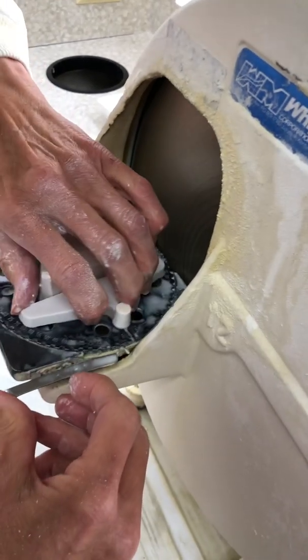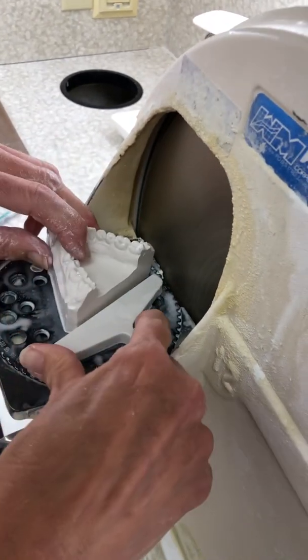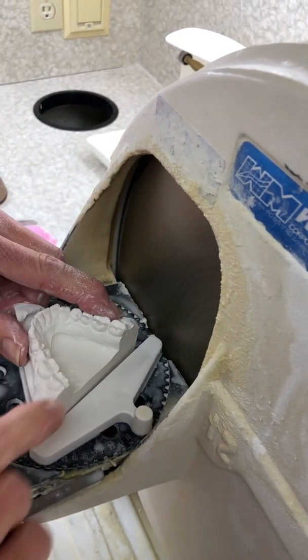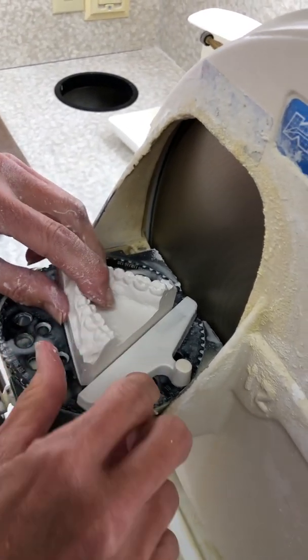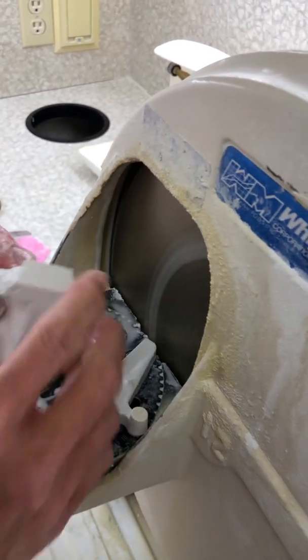So that's at 115. So 115 degrees, let's set our gauge for this and just push in. And you want to watch again that you've got to do it on both sides. So if you've got a tooth that's out a ways, just make sure that when you trim that you do the one that probably is going to have the most difficulty. So I've got my heel there.